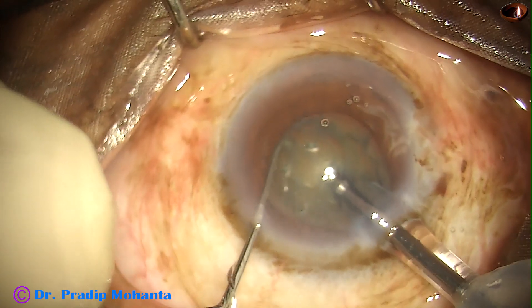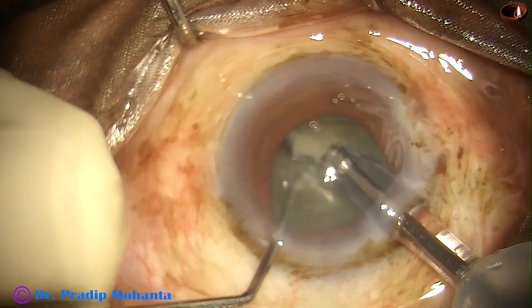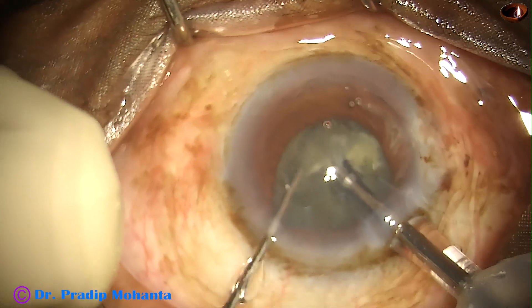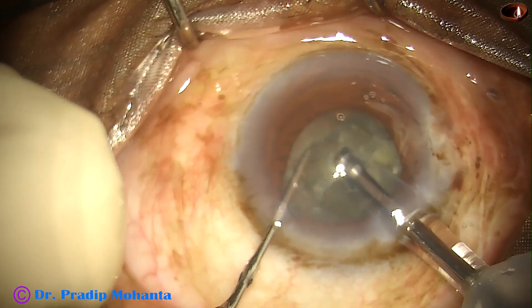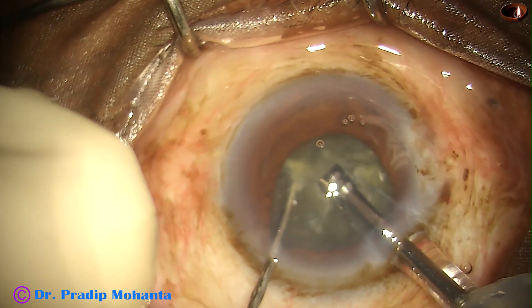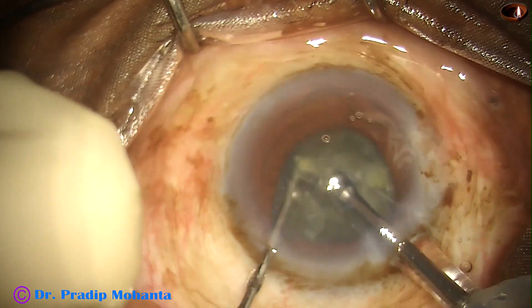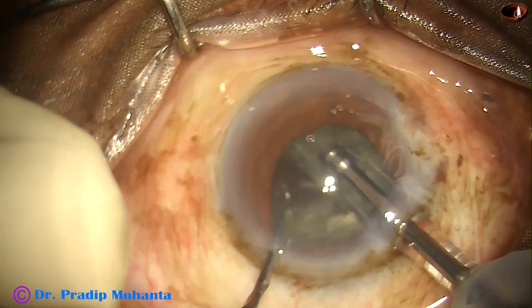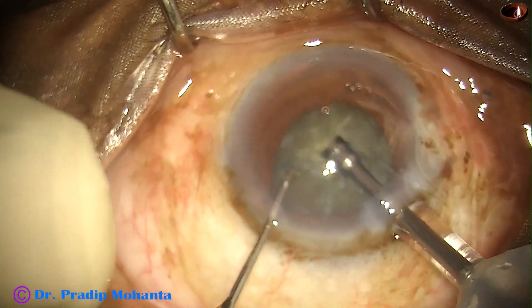And see the direct chop. The tip is buried into the substance of the nucleus and the nucleus is chopped into fragments. Vacuum is 400 mmHg, flow rate is 40, and ultrasonic energy is 60% in this case.